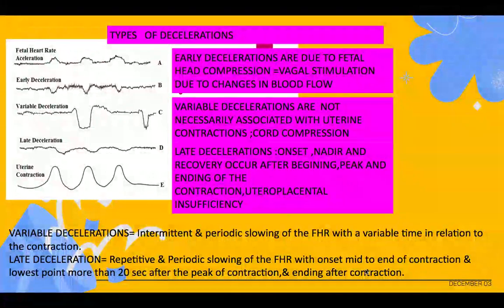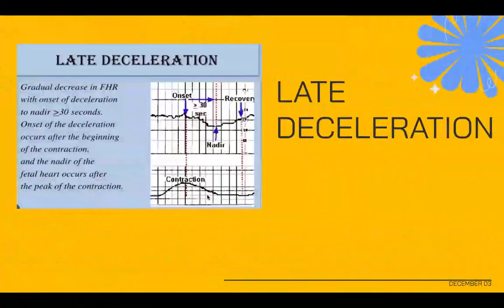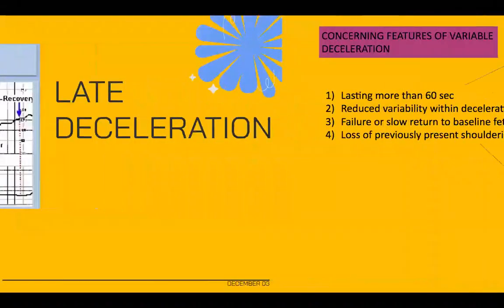And it ends after the contraction, right? And it is usually showing uteroplacental insufficiency. You cannot overlook late decelerations; they are important. These are again the picture. It is not necessary to remember when it is starting, when its nadir is coming, when it is recovering back. These seconds are totally unimportant to remember. Don't remember these things. Things are coming which I will tell you are the important ones.